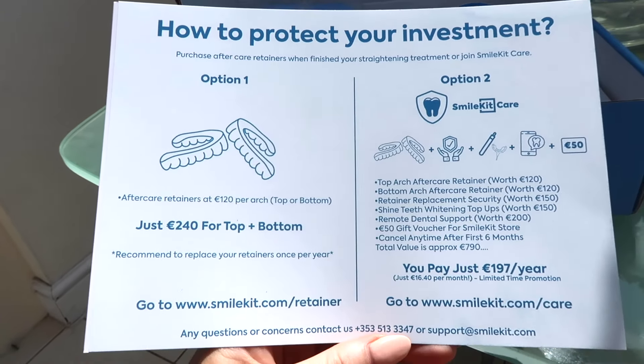You do need to wear them for 22 hours out of 24, which I think is very important. The guide then tells you about the final step, which is to purchase the retainers - something that I wish I had done when I was a teenager.